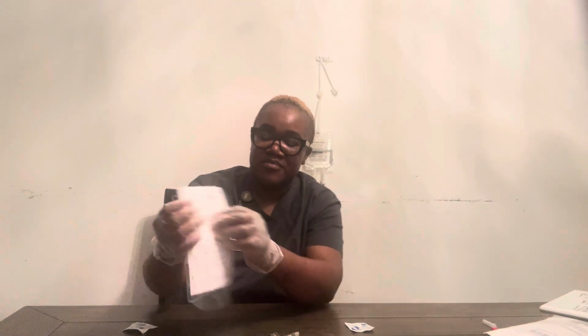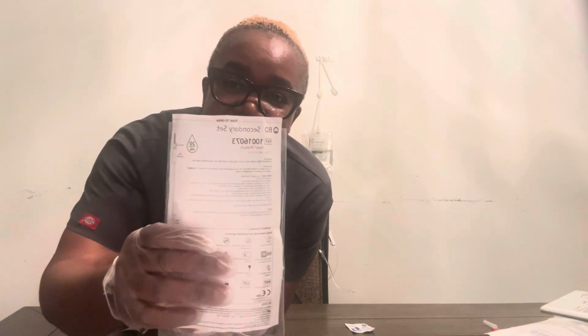I have a macro drip set, which is 20 drops per milliliter, and this is supposed to be running for 15 minutes.